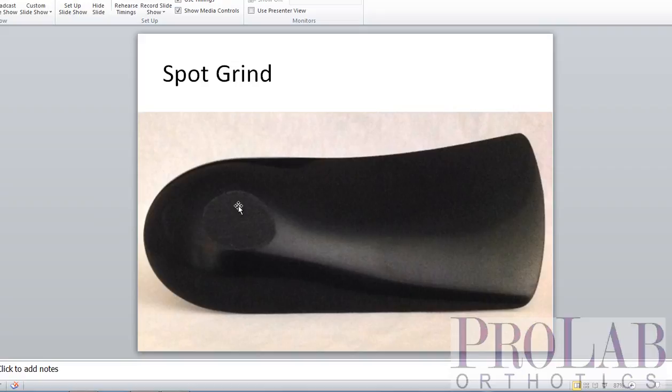Our second type, although this isn't really a post — with no post, we call this a spot grind. In this one, we just grind it flat on the bottom of the polypropylene orthosis. That flat portion makes the device a little bit more stable, though certainly not as stable as a rear foot post. But because there's no post, it fits easier into some shoes, making for a less bulky orthosis while still providing a little bit of stability.